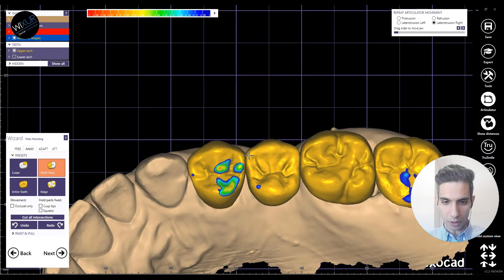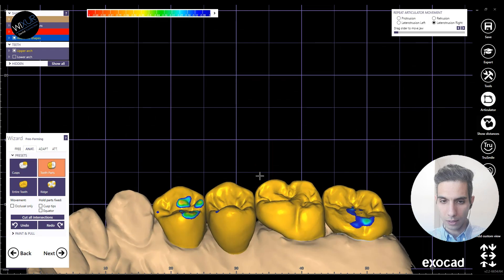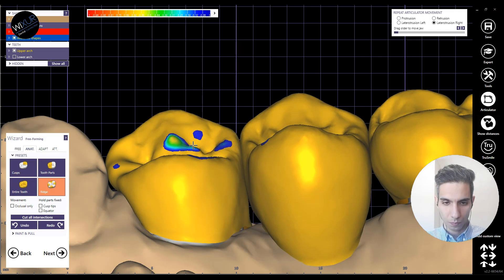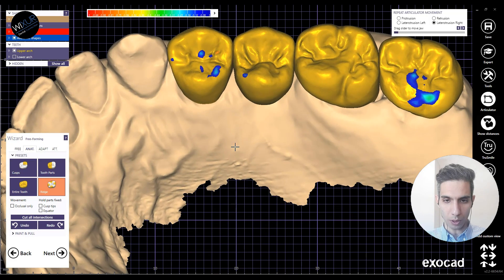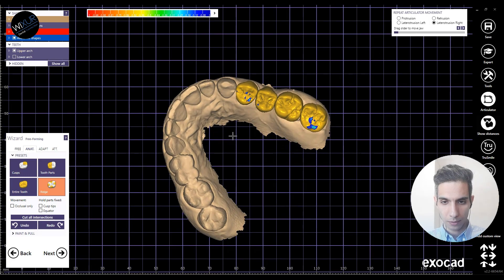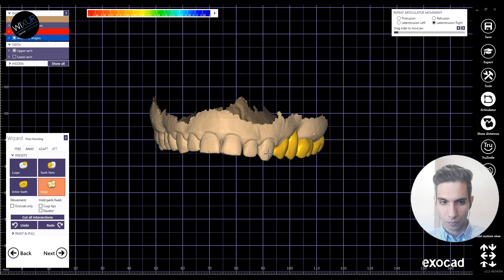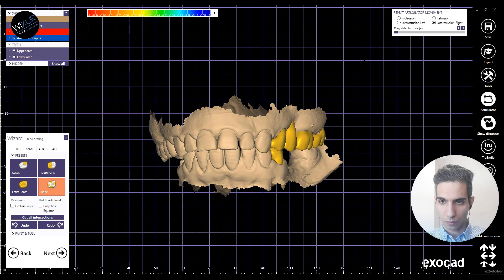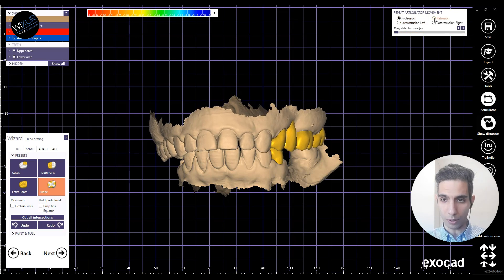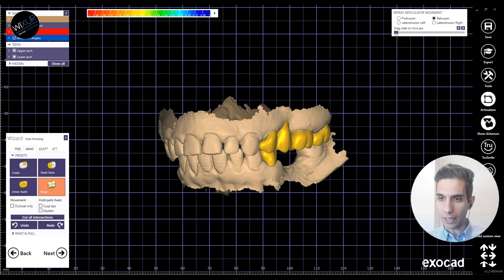We are playing a little bit with the line angles and point angles for a better look. I'm being a bit careful because I don't want to deform the whole anatomy. Let's see how the movements look now after adjusting all of them in the virtual articulator.